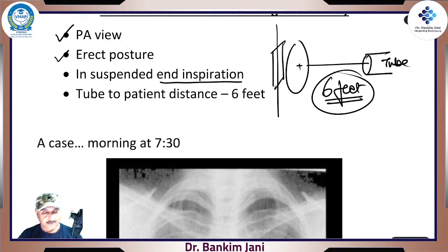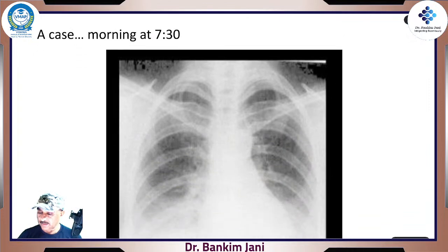Now here it is. Why did we say suspended inspiration? Why? We could have said, okay, fine, breathe normally, stop and take the X-ray. Now see, the logic behind it is, this is the alveoli, right?